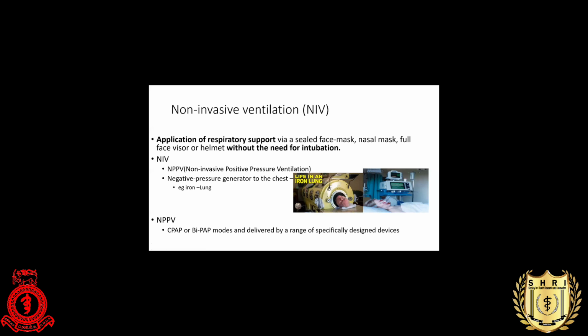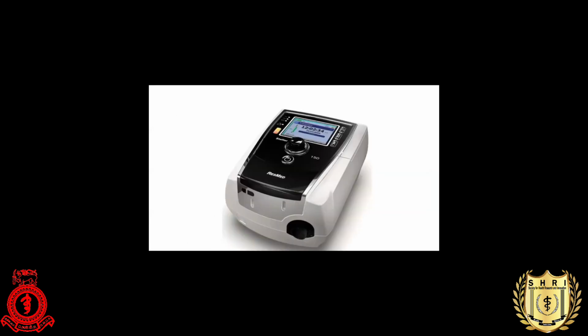Now we commonly use CPAP and BiPAP as non-invasive positive pressure ventilation. This is a respirator machine. It's very commonly used in the emergency department and high dependency care unit. It's very small compared with your conventional ventilator and easy to use. And I think it's cheaper than that.